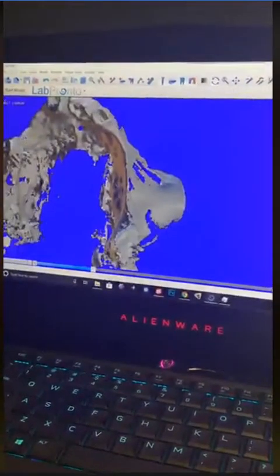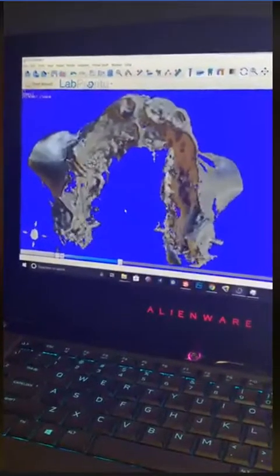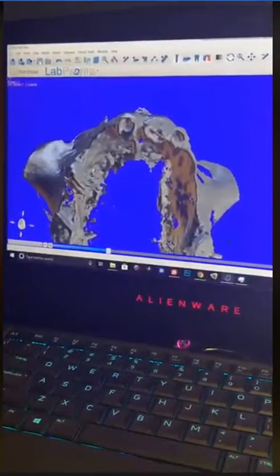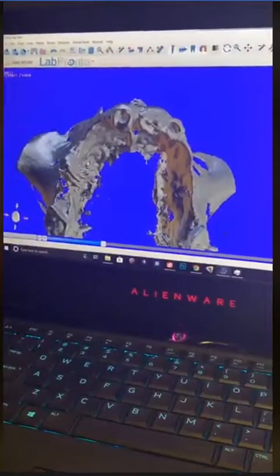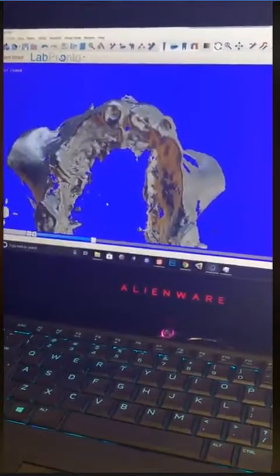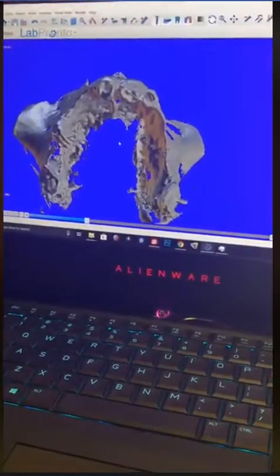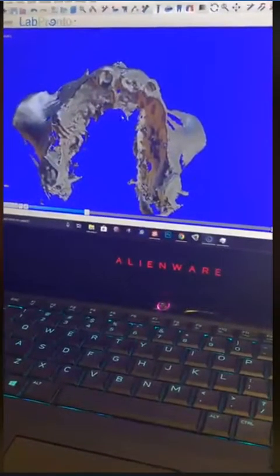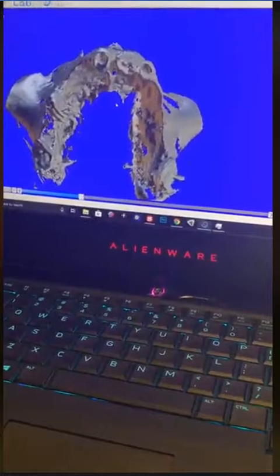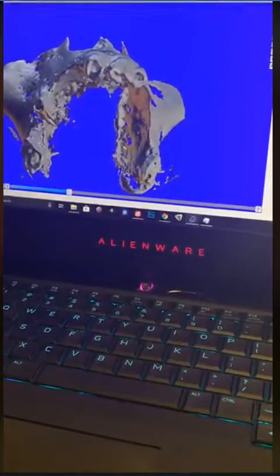Now take a look and see how much bone we have here. This particular patient, and we have a couple of teeth over here as you can see, is going to have an overdenture. We're going to place 4 implants for an overdenture. The minute you take these teeth out and you don't do anything as far as implants, even if you bone graft it, I'm not so certain that after waiting 4-6 months, how much bone is actually going to be restored and stay and not melt away. And what if a patient doesn't show up for another 1.5 years? Then that window of opportunity is actually closed.